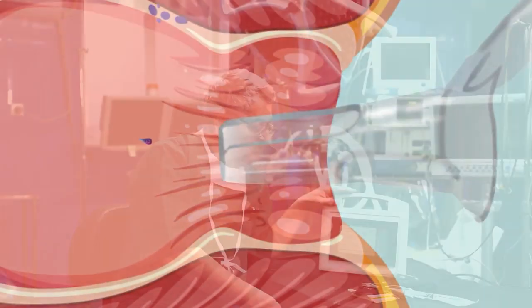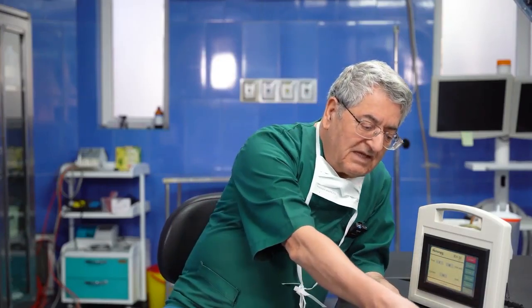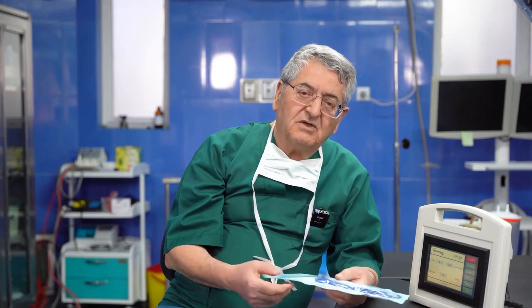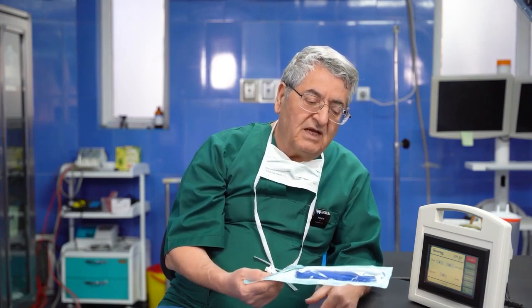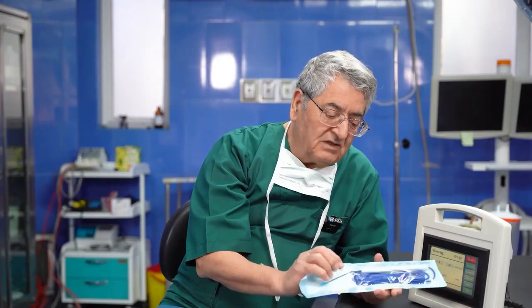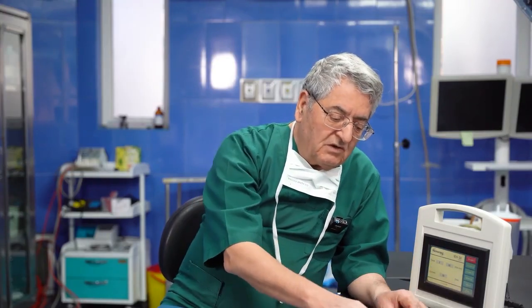In electrotherapy for hemorrhoids, we specifically use a sophisticated device that efficiently converts alternating current electricity to direct current and then applies it in a very specific and controlled way. The electrode is gently inserted into the hemorrhoidal bundle, and within a few short minutes, noticeable changes begin to occur within the bundle, ultimately leading to its complete destruction.